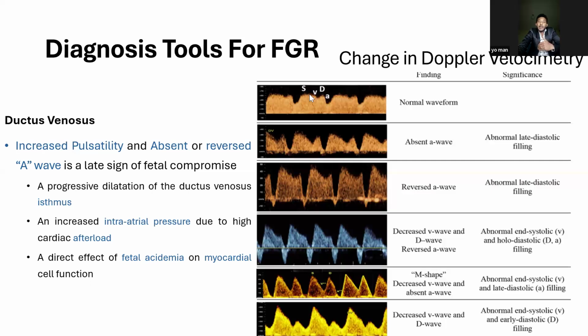So based on the cardiac cycle, the S wave, V wave, there is a certain deceleration here in the late systole. Late systole is indicated by the V wave, and the systolic upstroke is indicated here. And then the atrium will be filled with blood. When the atrium is filled with blood, then the resistance develops. So it's indicated here, which is technically early diastolic flow or passive diastolic flow of the atrium.